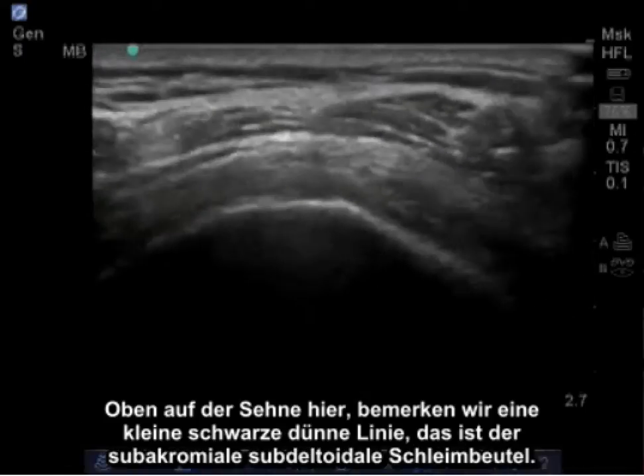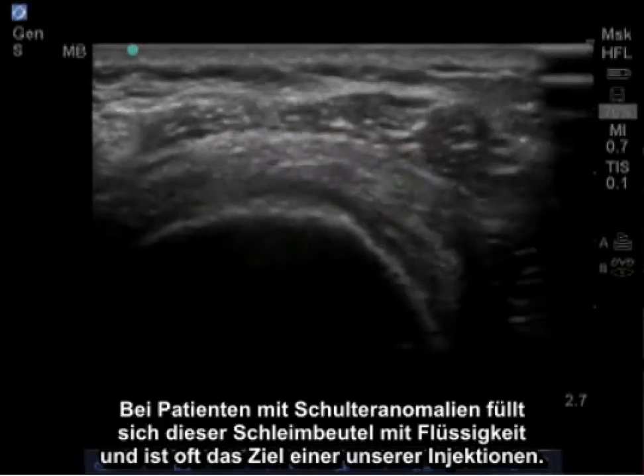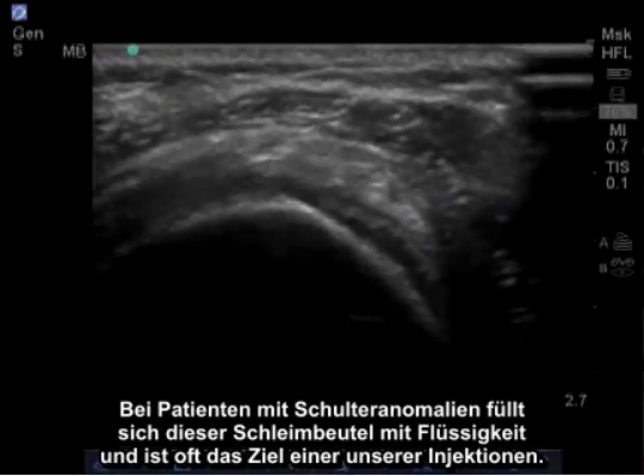On top of the tendon here, we notice a little black thin line which is the subacromial sub-deltoid bursa. In patients with shoulder abnormalities, this bursa fills with fluid and is often the target of one of our injections.